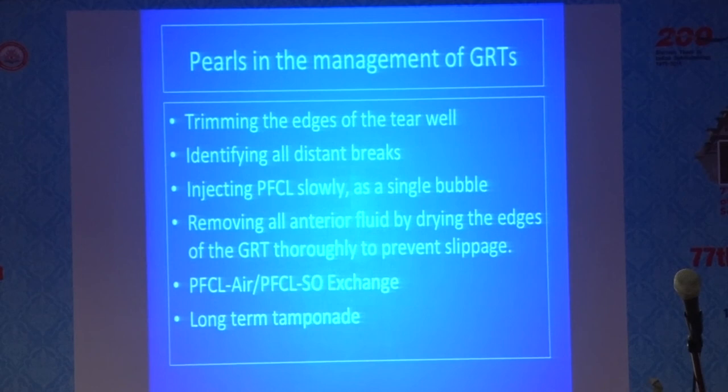So the pearls are: trimming the edges of the tear well, identifying all the distant breaks, injecting PFCL slowly as a single bubble, removing all anterior fluid by drying the edges of the giant tear thoroughly to prevent slippage. PFCL air or PFCL oil exchange works, both can work, but they have learning curves to them, and a long-term tamponade is needed, whether you do silicone oil or maybe C3F8.